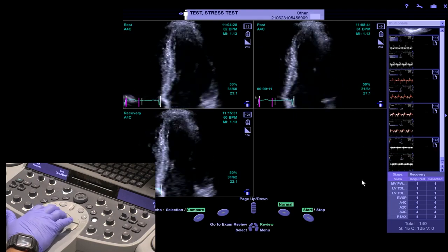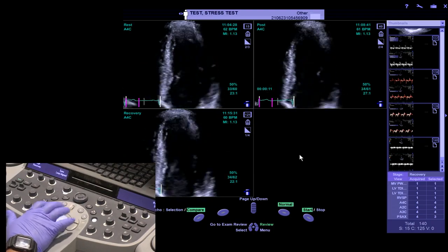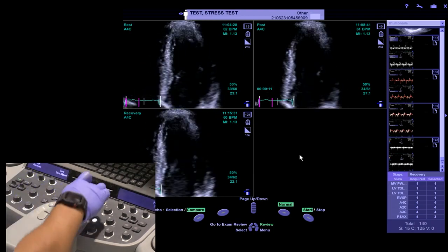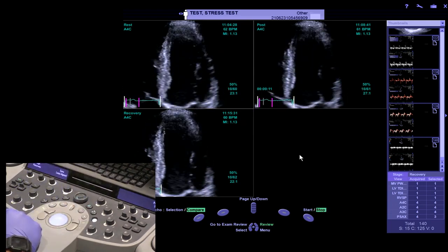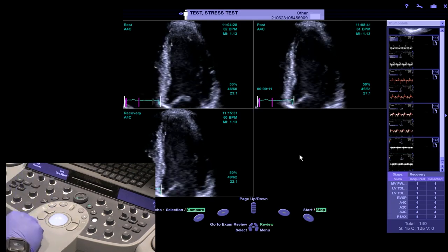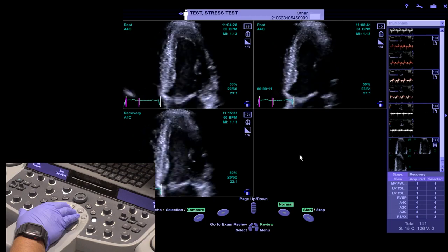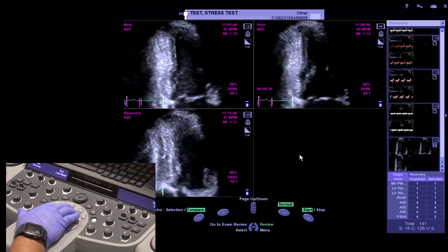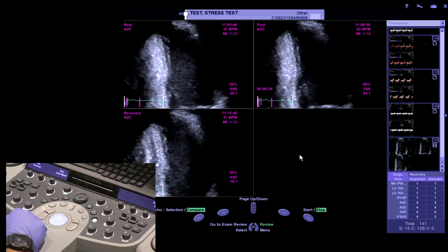Once you've done that, again, a workaround for a Syngo Dynamics problem is to acquire the review image as a live acquisition. That way, it makes it a single image showing all 3 stages for your physicians to easily review. And I would encourage you to do that for each individual view.